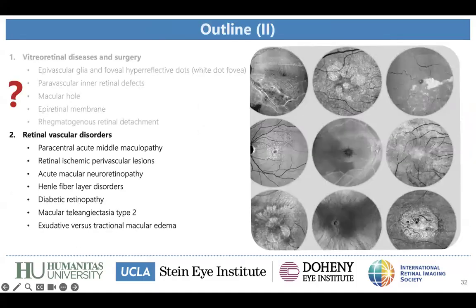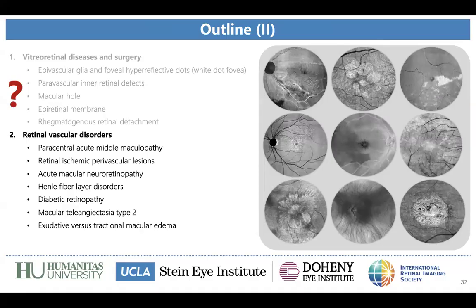I have two questions. First, the one you just answered about the ERM, how to bring en face to practice. Like you said, you can first grab the ERM where it's easier through en face. I have another question.